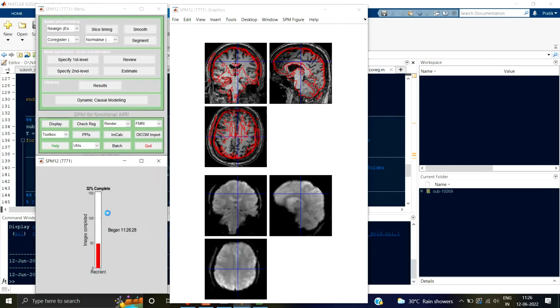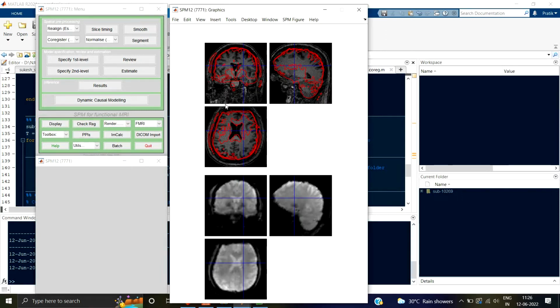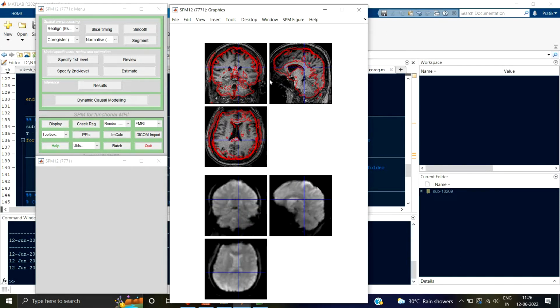Okay, so here it is reorienting now, and that's it. I mean, your images are reoriented. You can see now it's so beautifully realigned to the anatomical image. So this is one way that you can manually do the co-registration.